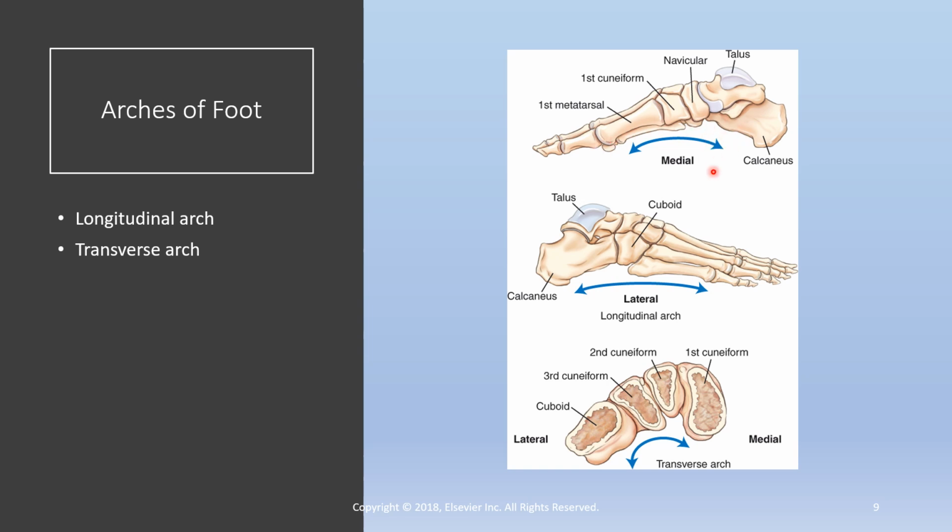Okay, so when we do feet and we have to determine the angle on the tube, we want to view the arch from the medial side of the foot, meaning the first digit side, not from the lateral aspect, because it would always appear much flatter than it does from the medial aspect.